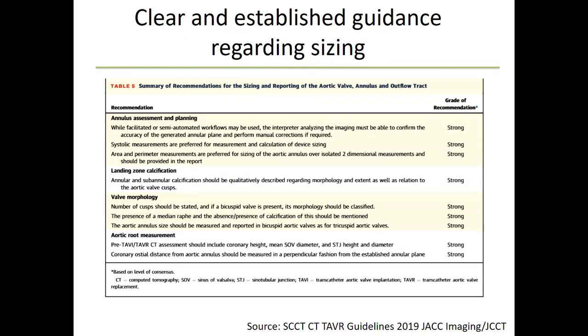I don't have any answers for you on that, but I think that's something we collectively can look at, as we saw from Dr. Waxman with these new devices, better understanding these things. The SCCT put out guidelines this year, led by Philip, and really highlighted, I think, our recommendations for sizing. And I think this is important to understand: if you're using CT, you need to do it in a consistent way.